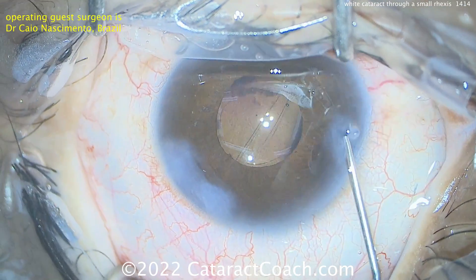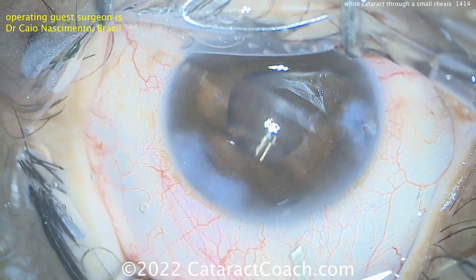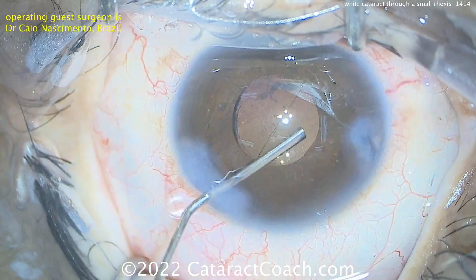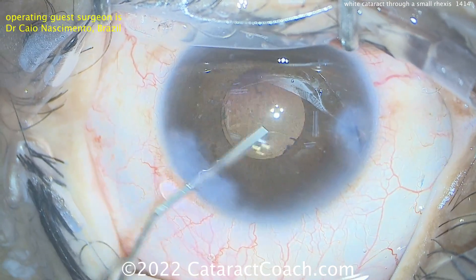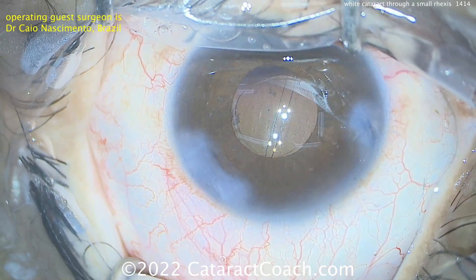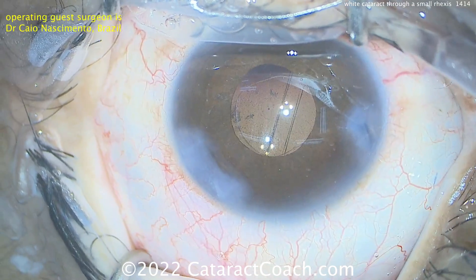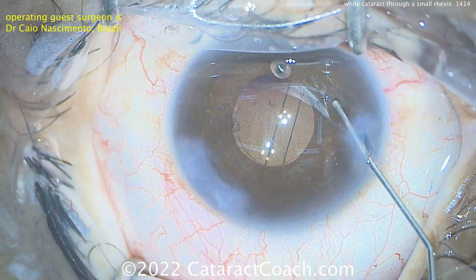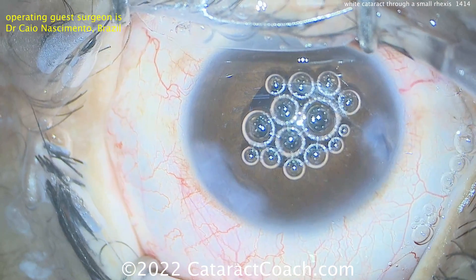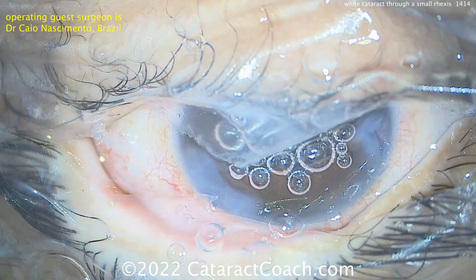Beautiful case. But what's our take-home message here? You can definitely do a smaller rhexis in a case like this. I would have done a big rhexis — a 5mm rhexis, bigger than the pupil dilation — remember using that Jedi mind force, you can just make it larger. In this case however, Dr. Nascimento did a 4mm rhexis and it worked out beautifully with that impressive skill set. So bottom line: do what makes you happy and what's safest in your hands.